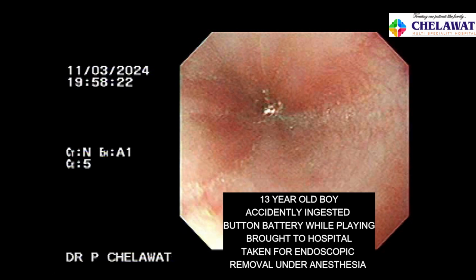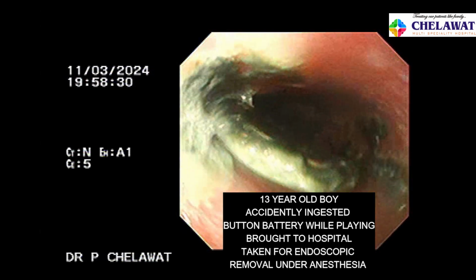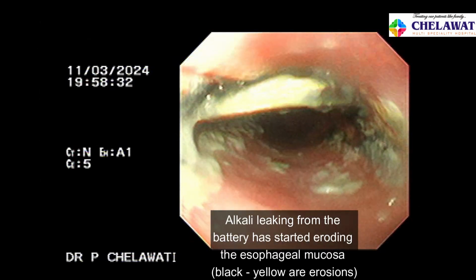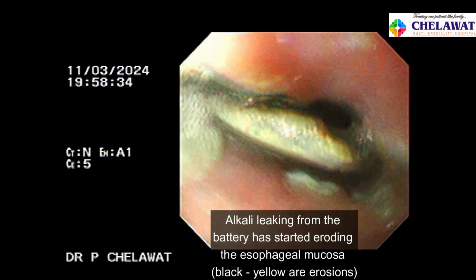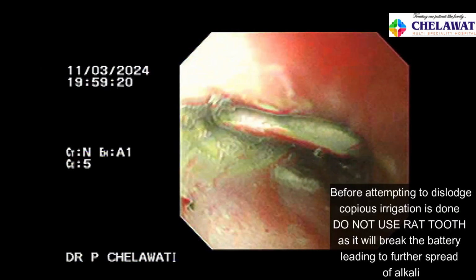Because it gets impacted into the esophagus, releasing the alkali. These are some tips and tricks of removal, and this is the endoscopy. You can see that in the food pipe, the button battery has accidentally lodged, the alkali has leaked from the battery and has started eroding the esophageal mucosa.